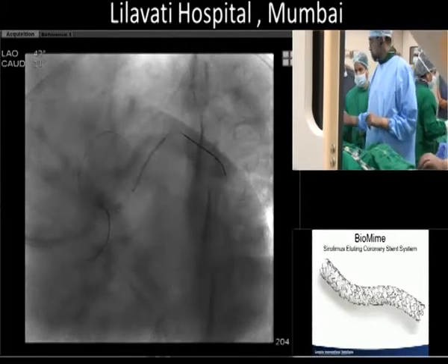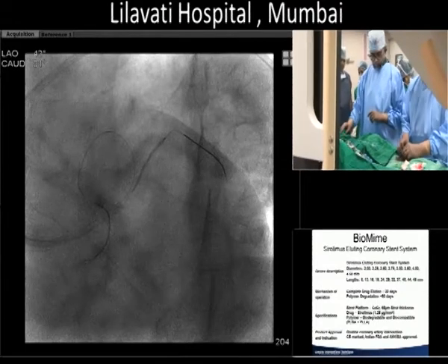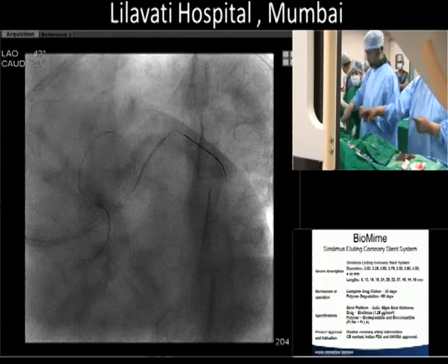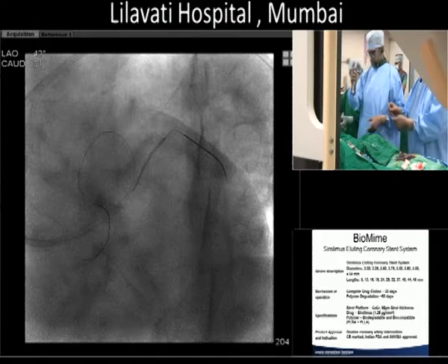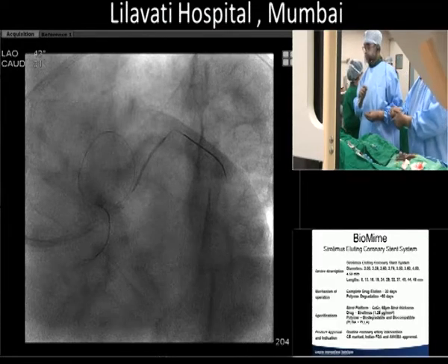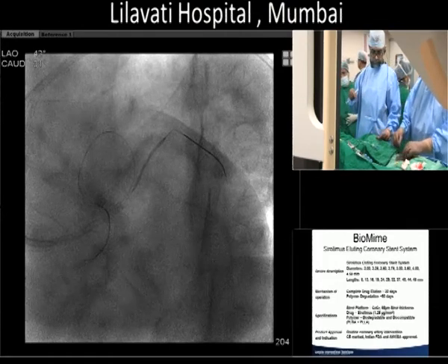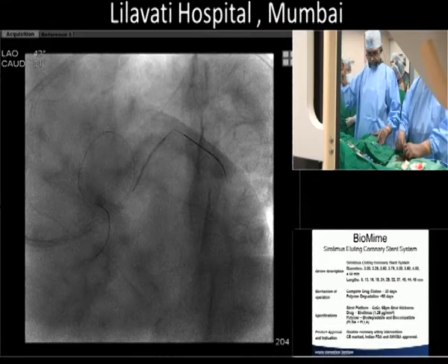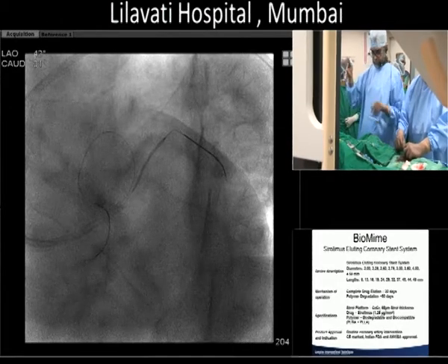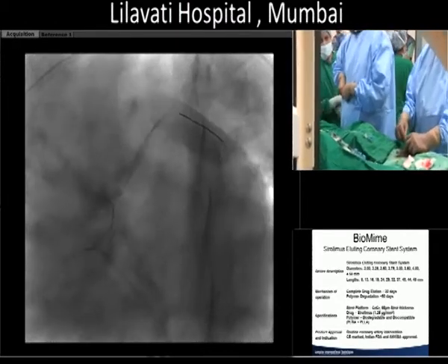Okay, give the 2 mm balloon, in case of any compromise, at least we have access wide open. Yeah, I think that's the key point, we should not have any problem. Often it's not plaque shift, but carinal shift, but still you don't want to lose access to your LAD, and so having an uninflated balloon parked in that LAD that's diseased is probably safe, especially when you have that ability.